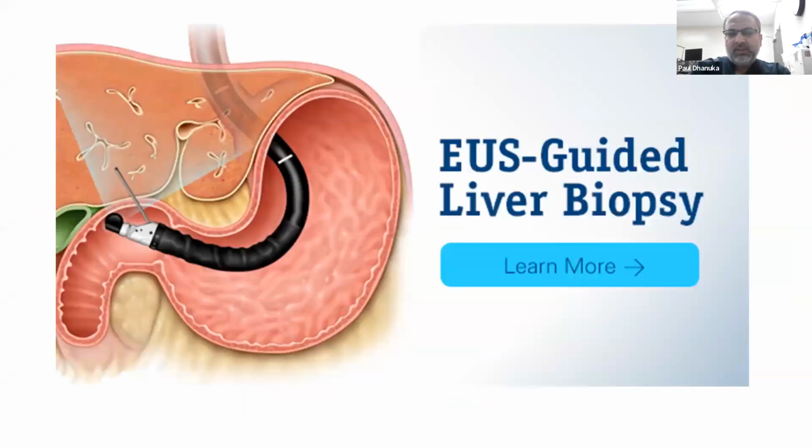The same way, you can go into the stomach or the duodenum and look at the liver, and if you find metastasis there, then you can biopsy them. Many times CT scans or MRI can miss these metastases in the liver, and they can only be seen on endoscopic ultrasound. There have been times when I have identified small metastases, 7 millimeter, 8 millimeter, less than a centimeter, and the biopsy showed metastatic tumor to the liver.